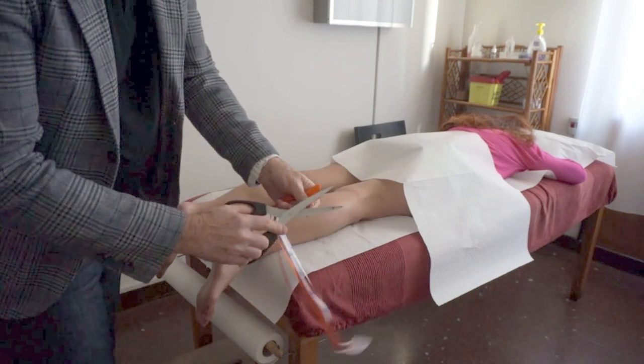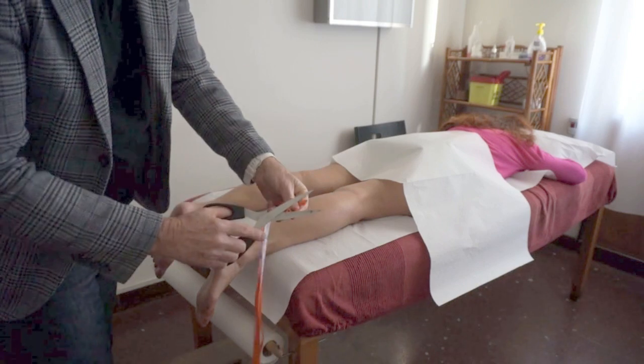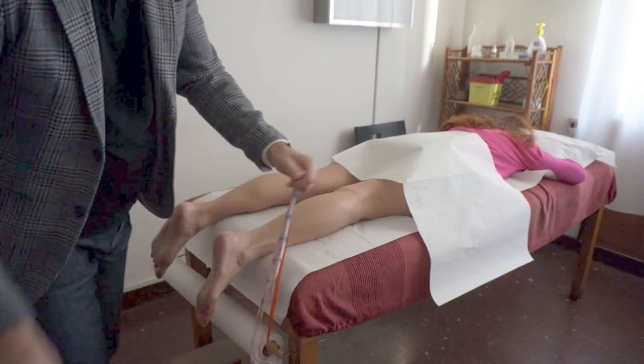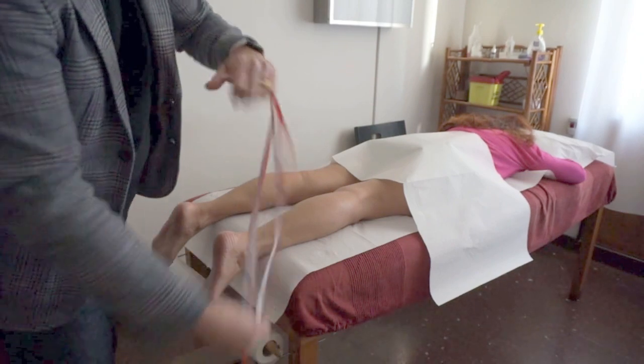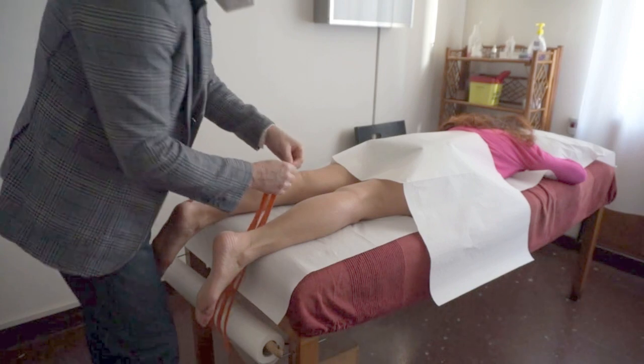The tape is going to be cut into a fan cut as you see here, with only 2 cm as a base. Each one of the 5 strips is 1 cm wide, which is the basic width of the tape for lymphatic purposes.